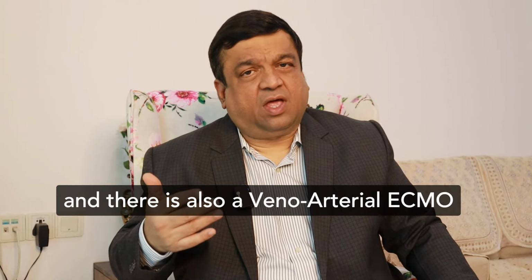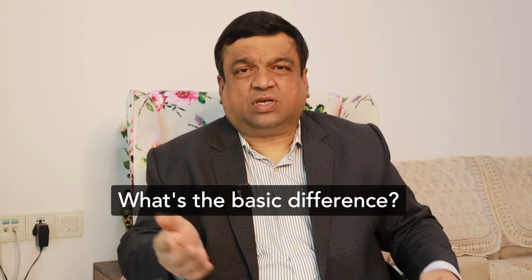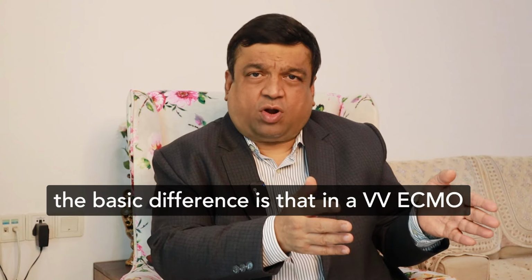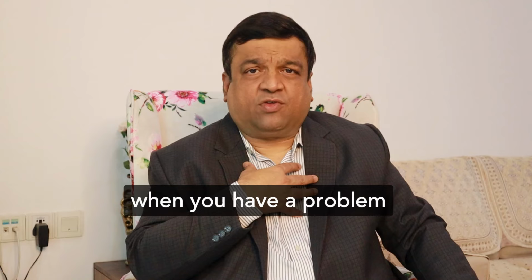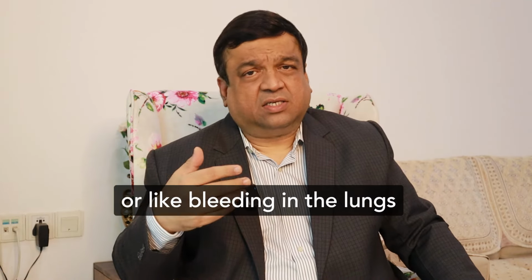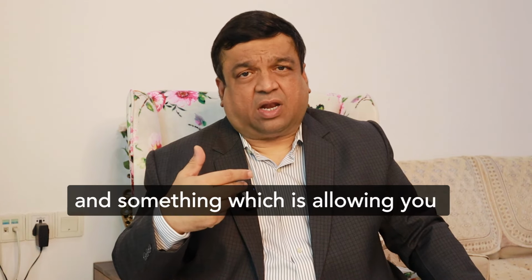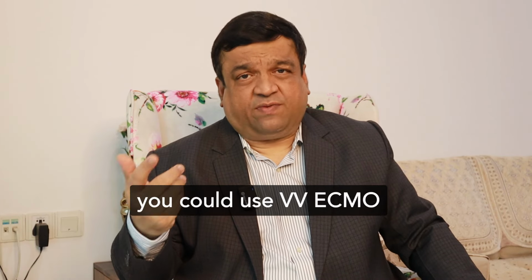And there is also a veno-arterial ECMO called VA ECMO, which is used for cardiac support. What is the basic difference? The basic difference is that VV ECMO, or venous ECMO, is used for your lung support, when you have a problem with your lungs like ARDS or bleeding in the lungs, something which is impeding your oxygen absorption capacity and allowing you to have a type 1 or type 2 respiratory failure, you could use VV ECMO.